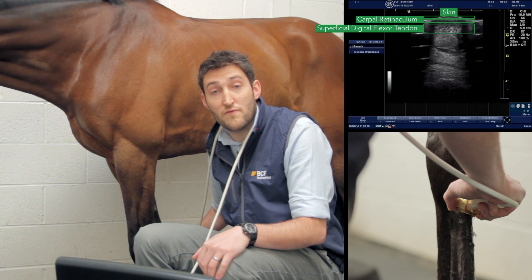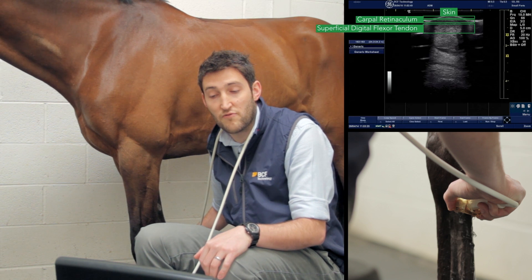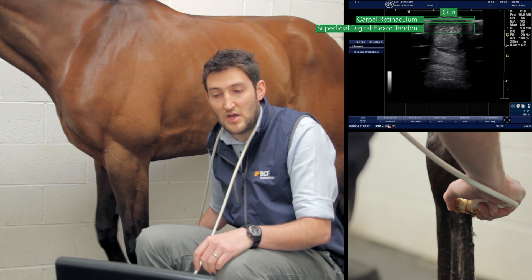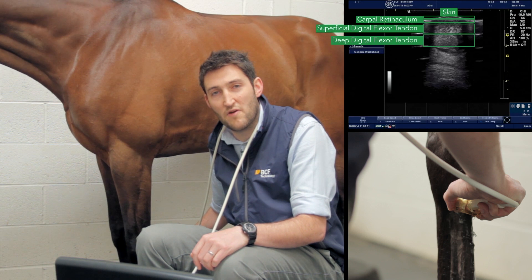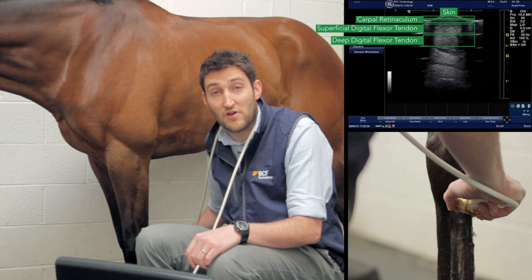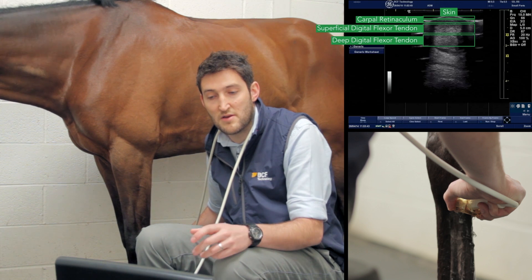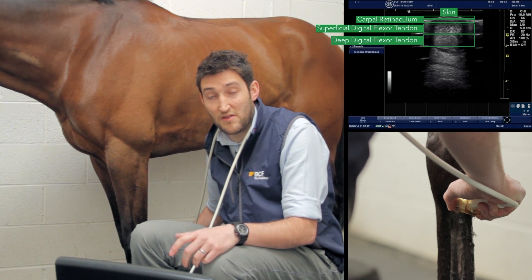The first big structure is the superficial digital flexor tendon, which is oval shaped and slightly more rounded on the medial side compared to the lateral side. It's slightly hypoechogenic relative to the structure below it. The deep digital flexor tendon below is slightly darker, roughly oval to slightly triangular, and more rounded on the lateral aspect.